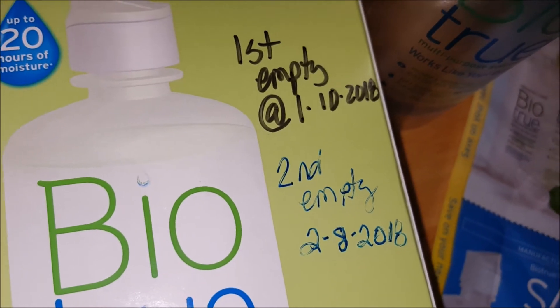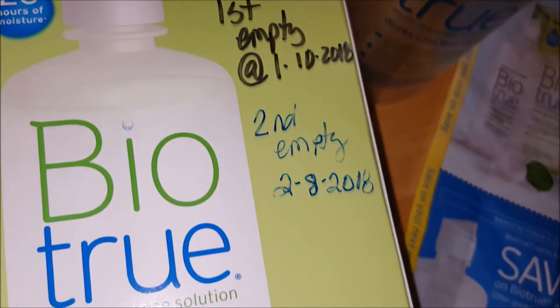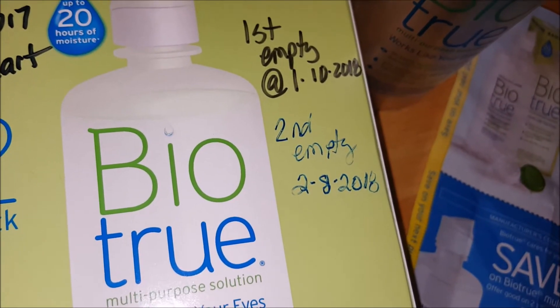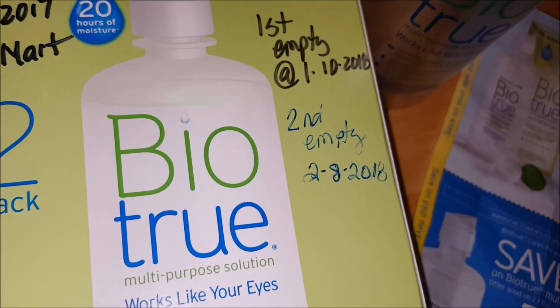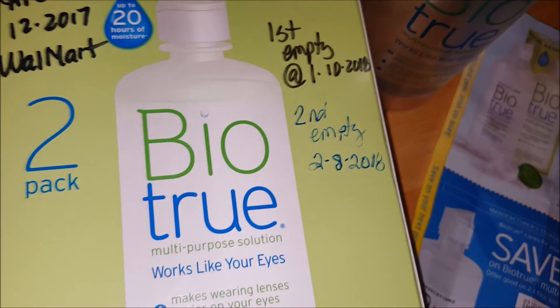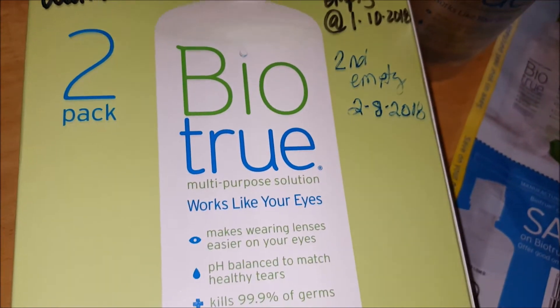I do use it every morning to clean my lenses. I soak them in it at night and then clean them again when I put them in the morning. So I clean them morning and night, which means I probably use a good bit of it. If you don't use that much, maybe it will last you a little bit longer.